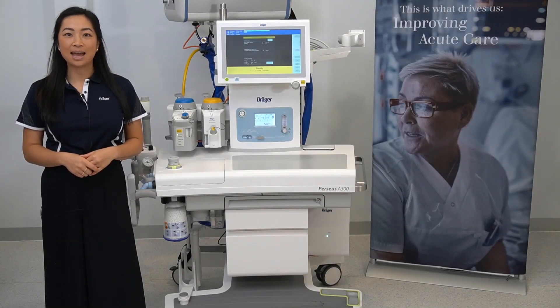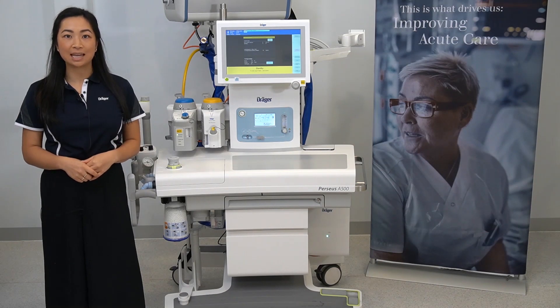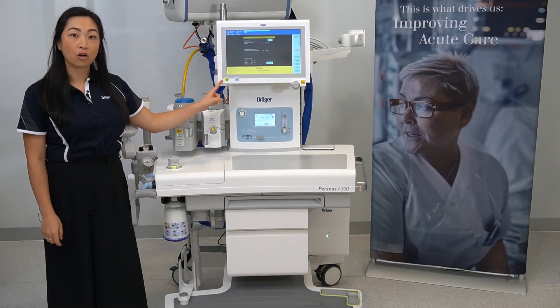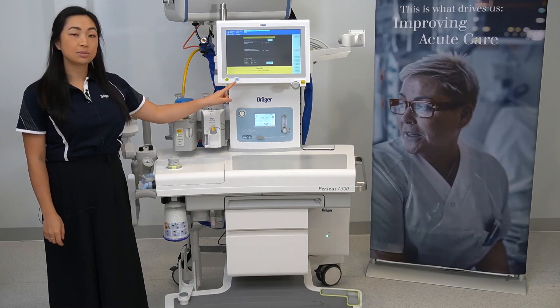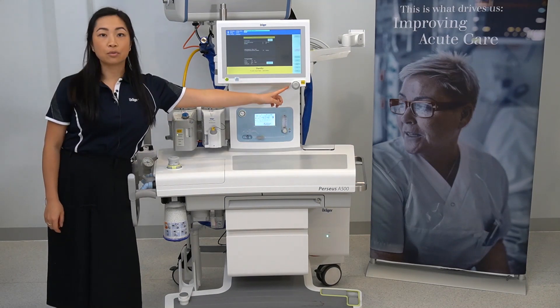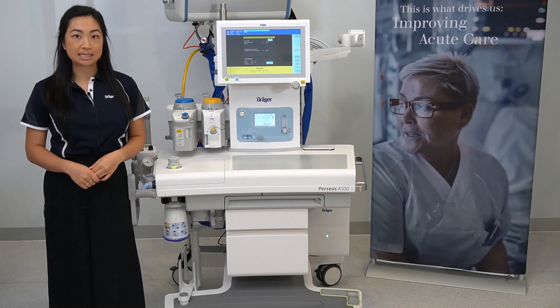Hello, my name is Samantha, and in this video I'll be orientating the user to the Perseus A500. Here is the main screen and the on/off button, the light switch which has three settings, and the rotary knob for making and confirming selections.